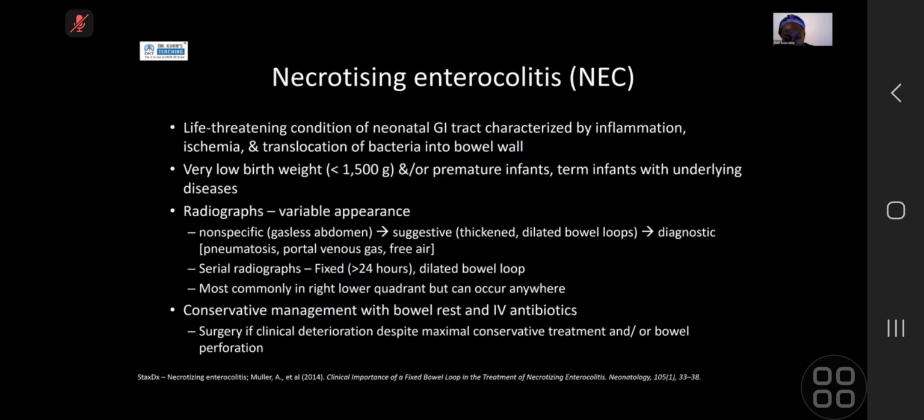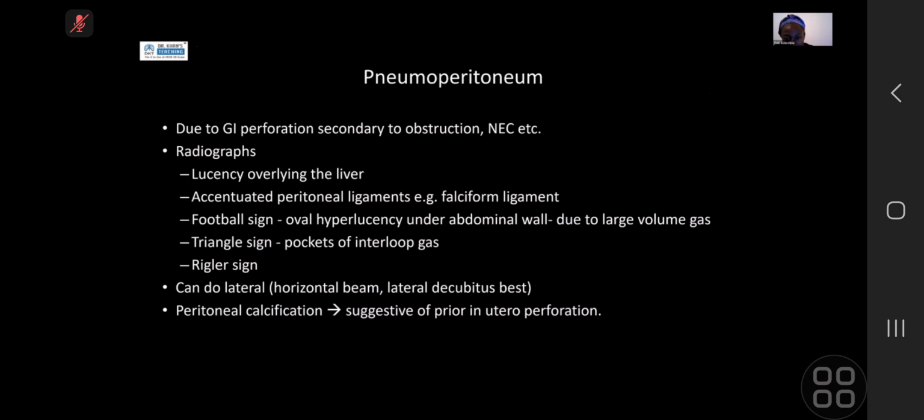So we've done that. Done the first NEC X-ray. In HIDA, how can you differentiate between neonatal hepatitis and biliary atresia? Didn't we have this conversation? I think I had this conversation with my regis yesterday.